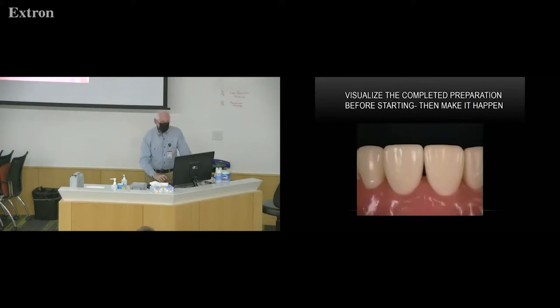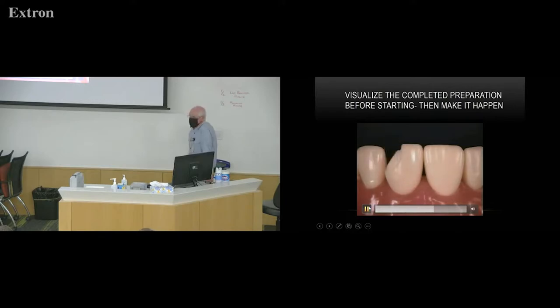Okay, so I've talked about this before, that in dentistry we need to look at the tooth and then visualize in our mind where we're going and what we want it to look like, and then make it happen. So let's watch this. So you're looking at the tooth, you're visualizing what it's going to look like, and then with your gifted hands, you're going to make it happen. So I don't think you're going to have too much trouble with this prep today. You've had enough experience now.